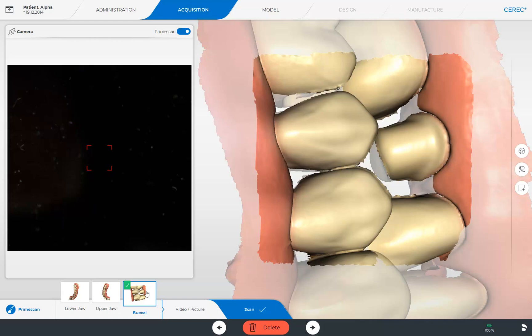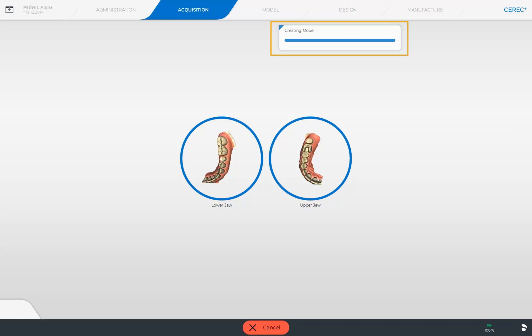Next, we switch to the third phase, the model phase. Before we reach the model phase, the CEREC software displays at which stage the model calculation is. First, the models are created. Next, the model axis is automatically set, and the preparation margin is automatically drawn.